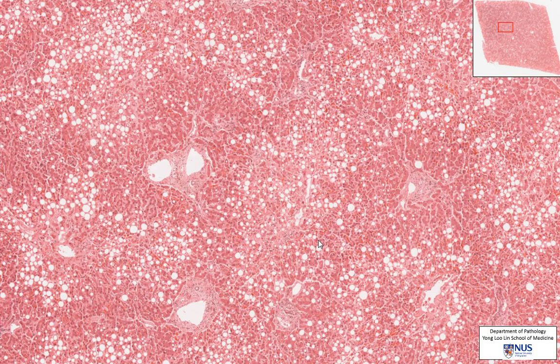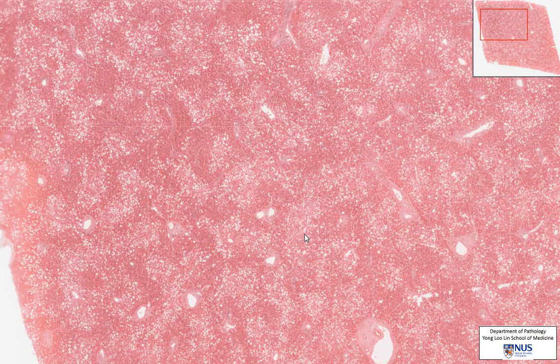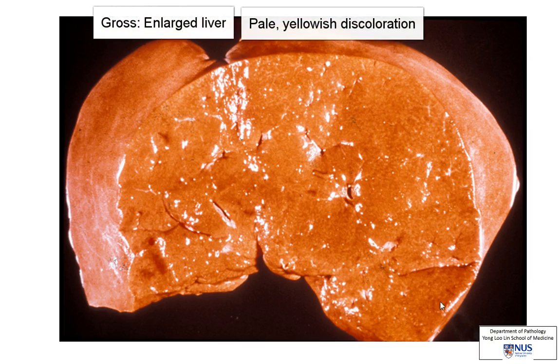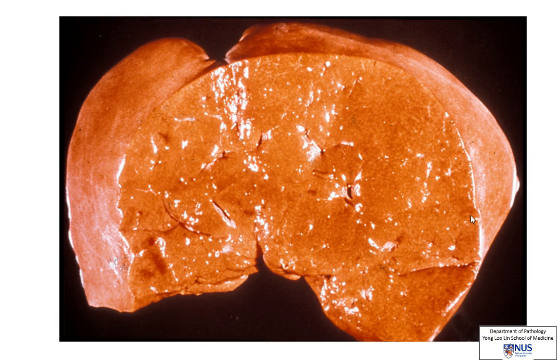I also want you to think about why this occurs in the centrilobular region, and how do you think this liver will look grossly. If there is a fatty change in most of the hepatocytes, what we will get is usually an enlarged liver, because you can also see how the lipid actually enlarges individual hepatocytes. We may also see a change in color, quite a diffuse sort of yellowish discoloration of the liver that is due to lipid accumulation.